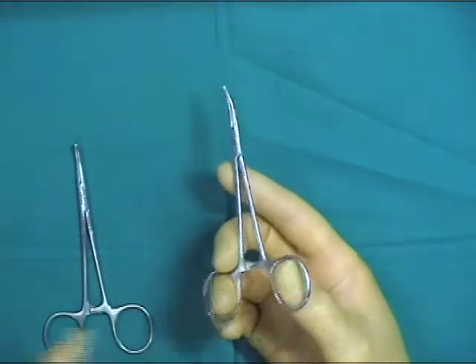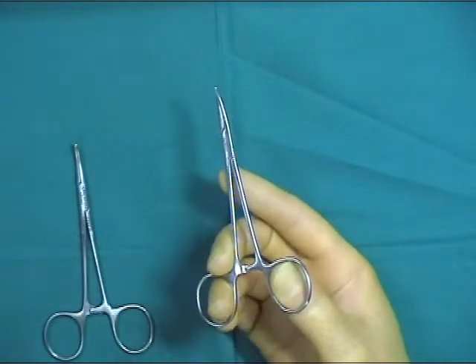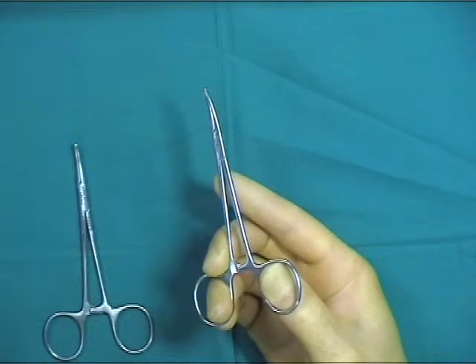The ratchet mechanism keeps the hemostat jaws tightly approximated and is unlocked by pushing the thumb in the direction shown.